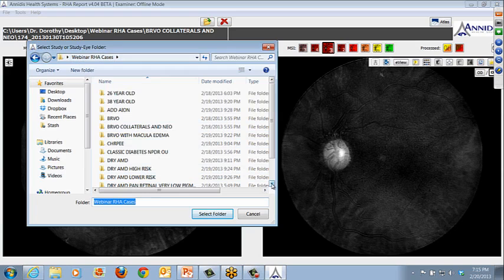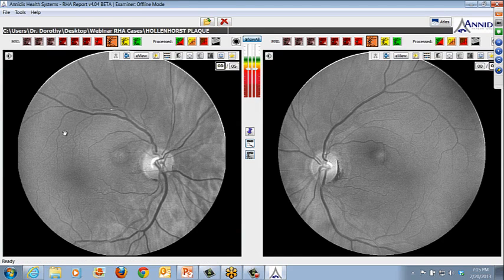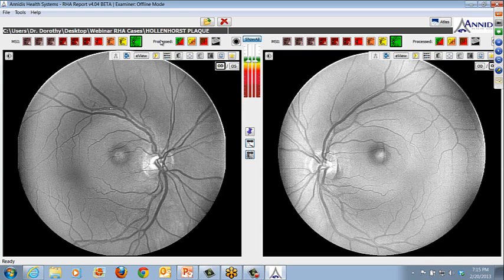So let's see here. I want to just show you some additional vascular differentiation. This is a patient from my clinic, completely asymptomatic, no visual changes, no amaurosis fugax, no prior cardiovascular event, but medical history of hypertension, hyperlipidemia, well controlled, strong family history of cardiovascular disease, non-smoker, in her 60s. She just went on Medicare, and so we did a screening on her. I tend to do the full spectrum screening often.